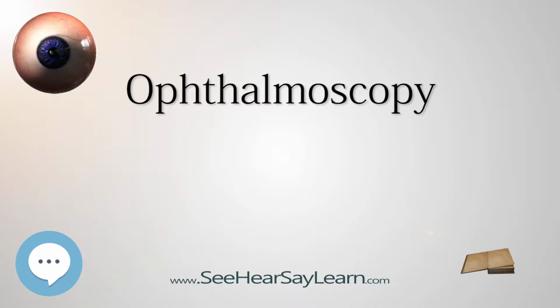The pupil is a hole through which the eye's interior will be viewed. Opening the pupil wider, dilating it, is a simple and effective way to better see the structures behind it. Therefore, dilation of the pupil, mydriasis, is often accomplished with medicated eye drops before funduscopy. However, although dilated fundus examination is ideal, undilated examination is more convenient and is also helpful, albeit not as comprehensive, and it is the most common type in primary care.